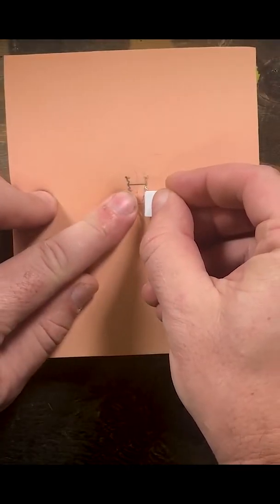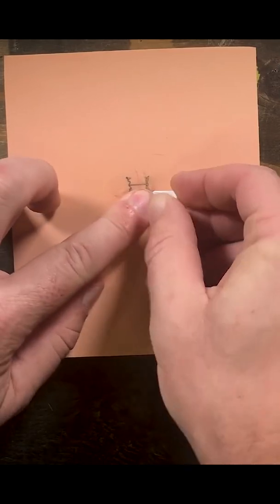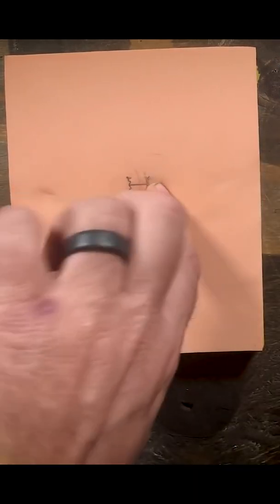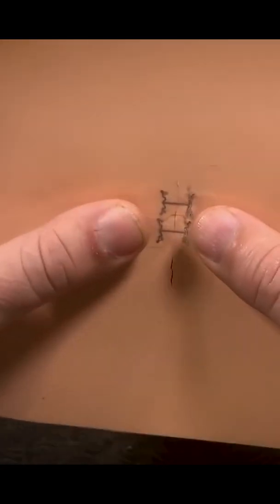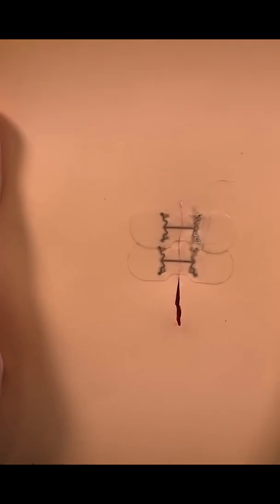Press toward the wound, stretch it a little bit, press, pull the tab. And there we go. A very strong solid closure right there.